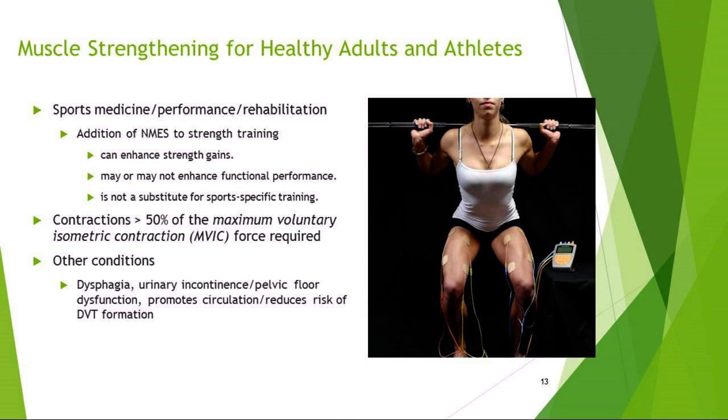In addition, the addition of neuromuscular electrical stim to strength training can enhance strength gains. It may or may not enhance functional performance, and it probably won't because it's not a substitute for sport-specific training. It's not going to make you better at your sport, but it might help make your muscles stronger.